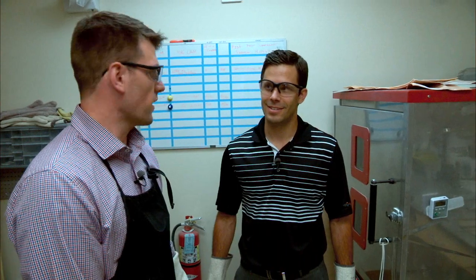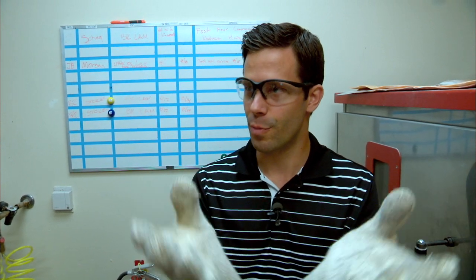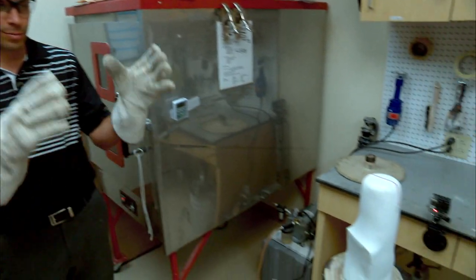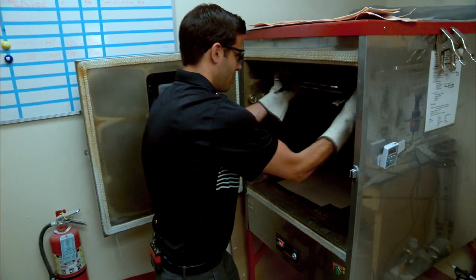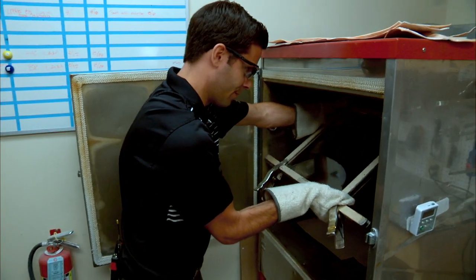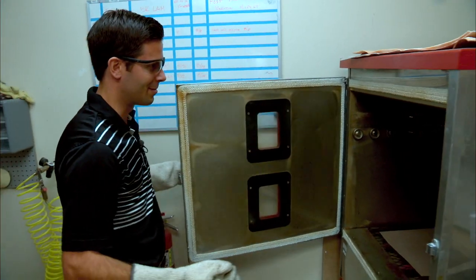I'm with Brian about to start the next step in the process, which involves a very hot oven — but I assume we're doing more than just baking cookies. What we're ready to do is create the check socket, which will be used as our diagnostic fitting tool. We've placed a half-inch sheet of plastic in the oven, letting it cook for 15 minutes. At the seven and a half minute mark, we take it out, flip it over, and it's going to droop and form a bubble. When the plastic is fully cooked, we'll flip it over the mold and the vacuum will pull the plastic around the mold. We cook this plastic at 400 degrees — and yes, Brian has been burned before, which is why we have the nice gloves.